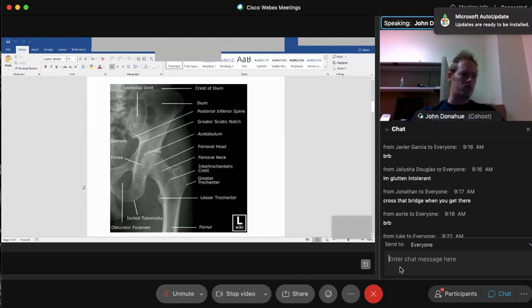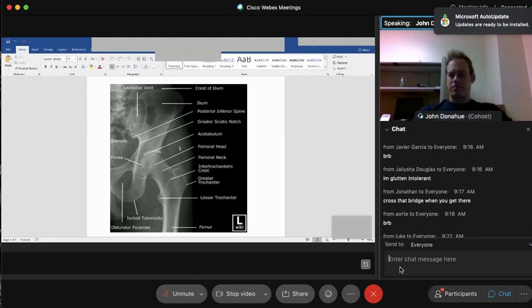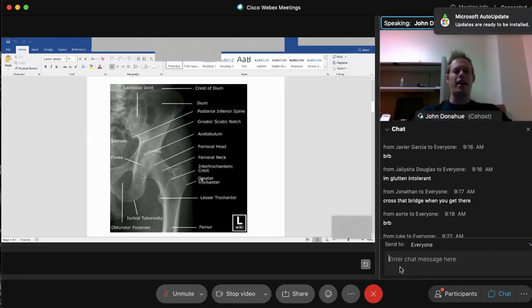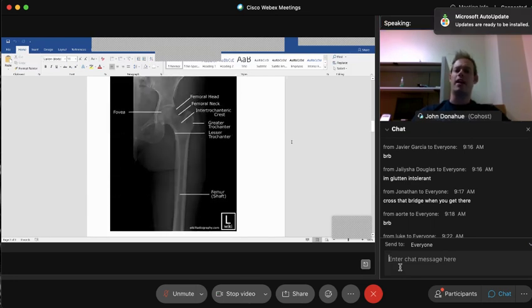And also, question real quick. Is this properly positioned? Or is this properly centered? Yes. No. Is it a miss? No. It's a pubis. No. The pubic symphysis is missing, so we need to actually repeat that x-ray. Even though the positioning's good and centering's okay, look at all this extra light over here. You could have moved that patient over more laterally to make sure they have that pubic symphysis on that x-ray. All right, what's this x-ray, guys?